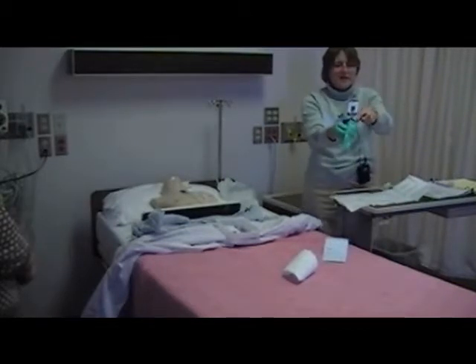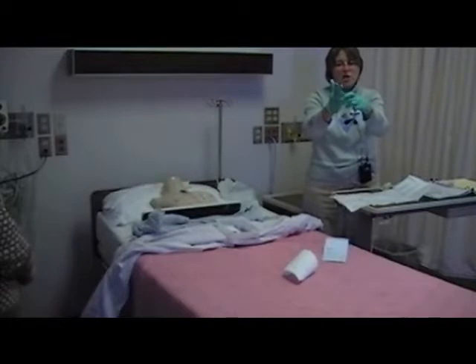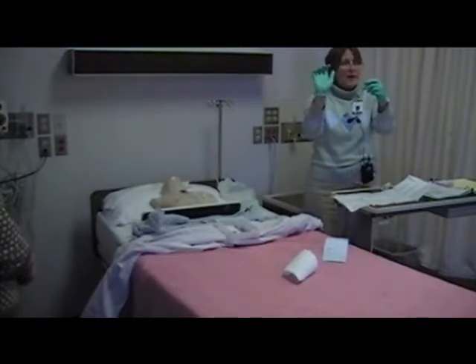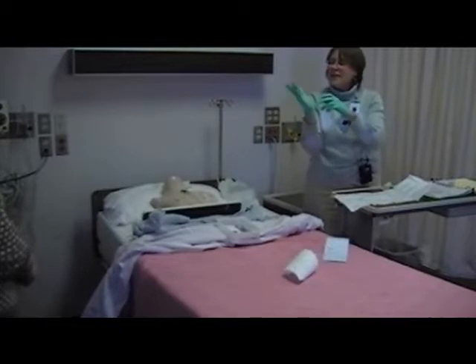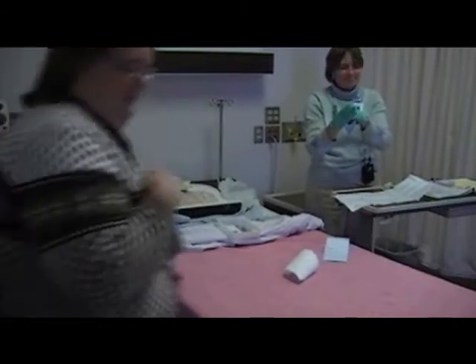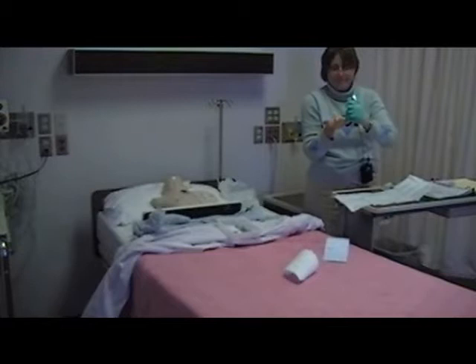Okay. And all this time I have not turned my back on my patient. I see him out of the corner of my eye. He knows not to be touching anything or talking over anything. Okay. And actually, I don't know if you can see, I don't like where that's ending. I want a new pair of gloves. So this is where I should have brought another pair of gloves in with me. So I'll have my assistant grab me a size 7. If you see 7s, otherwise there's a box in there that has extras.